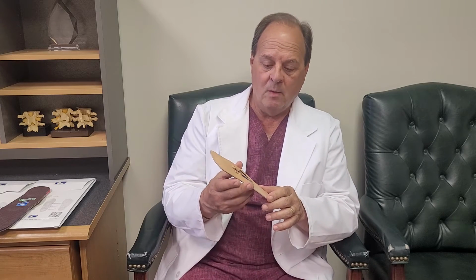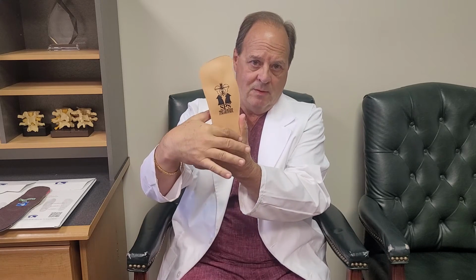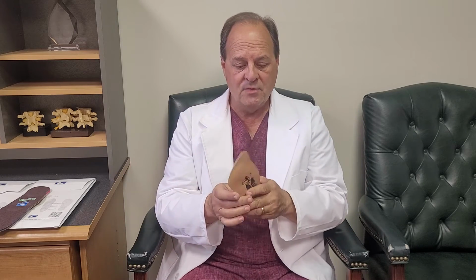Now, when you put the orthotic in your shoe, it needs to go all the way to the back of the shoe where the heel is. Otherwise, your foot's not going to fit in the proper place. So you need to put it all the way to the back, and when you put your shoe on, make sure that you're not sliding the orthotic forward. Also, this orthotic is for the left foot. You can tell because of this curve here, which is the medial arch. So you have a left and right foot. Sometimes people reverse that, in which case it's going to be uncomfortable. So always make sure you're putting the correct orthotic in the correct shoe.